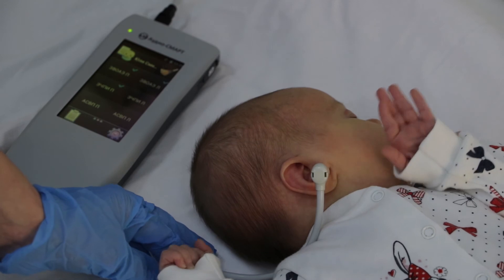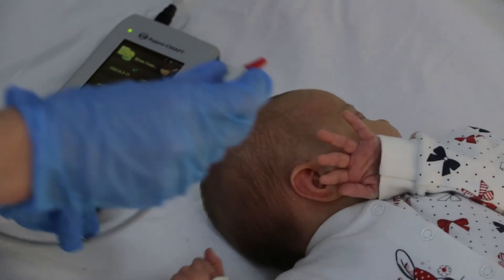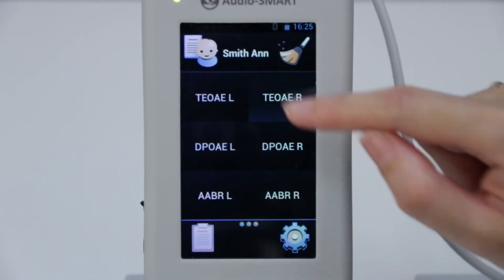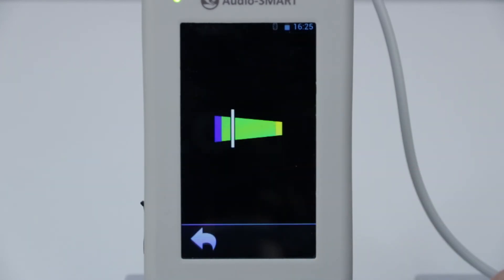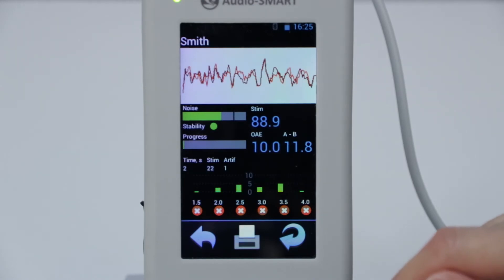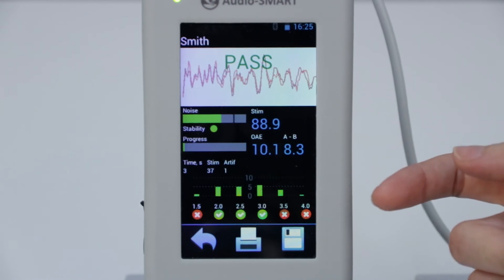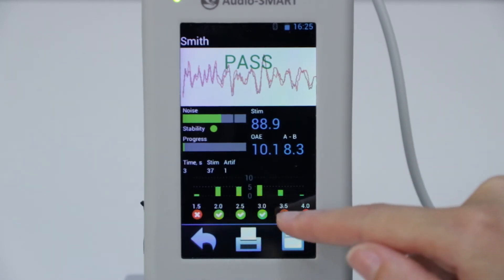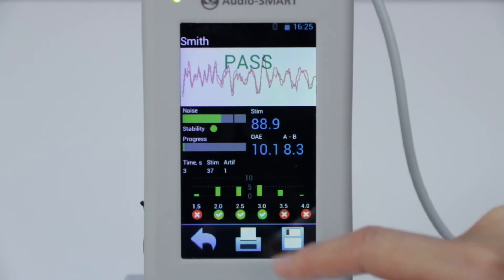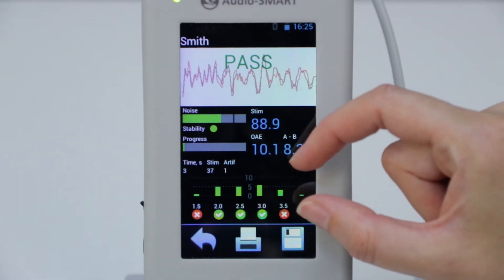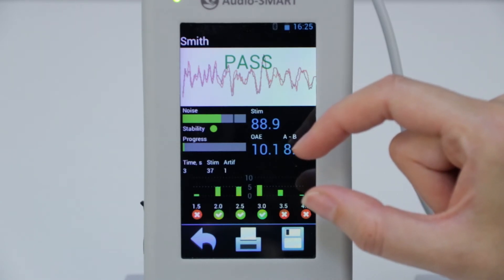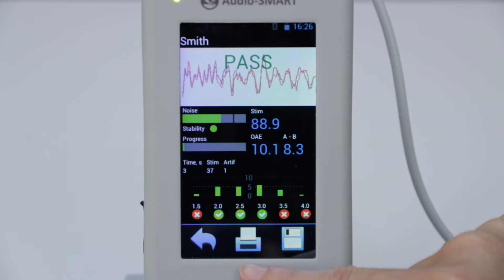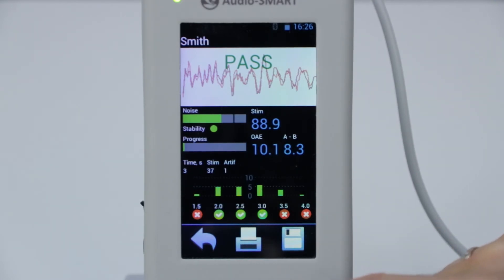And we get the result: pass. Now let's register the tests again and look at the results in more detail. We need to choose the side and the test will start automatically. We see the calibration of stimuli and the progress of the test. We required only a few seconds to get a pass result automatically, because the device detected that in three out of six frequency bands we have the signal-to-noise ratio more than the criteria in the template — more than 3 decibels. We can print the result via Bluetooth printer and save it.